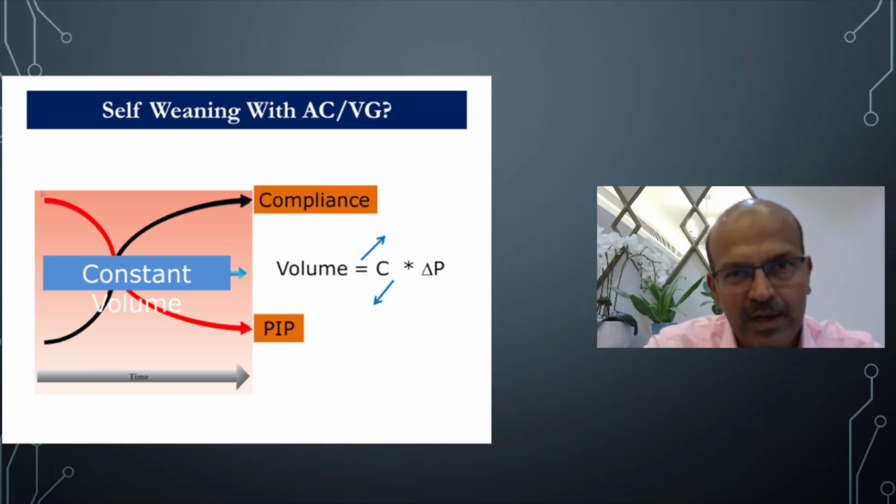So what you do depends on your unit practice, and I often say that you shouldn't be dogmatic about a particular mode. Majority of the time, 90% of the time, volume guarantee works, but in the 10% that you feel it doesn't work, don't hesitate to change back.